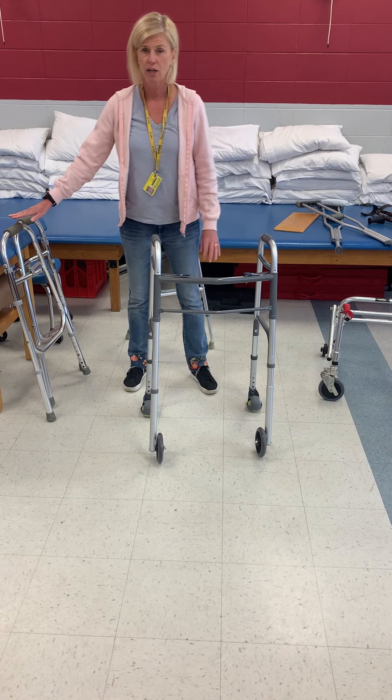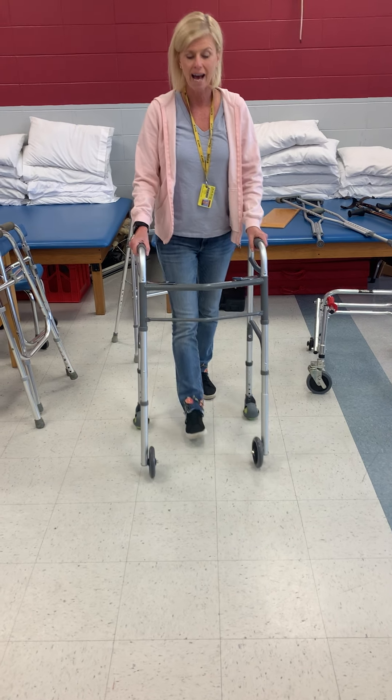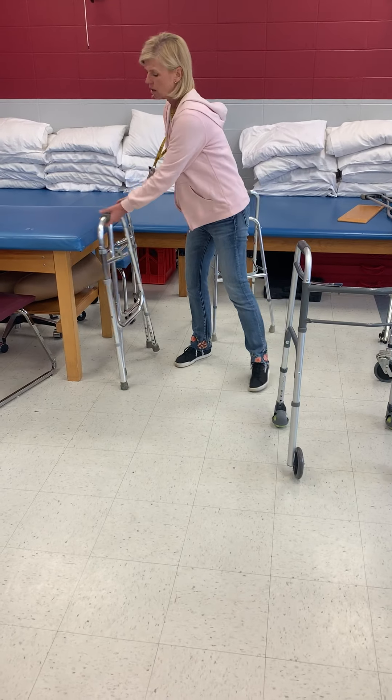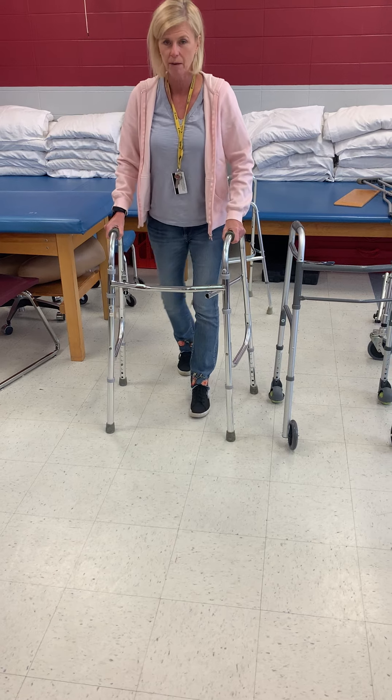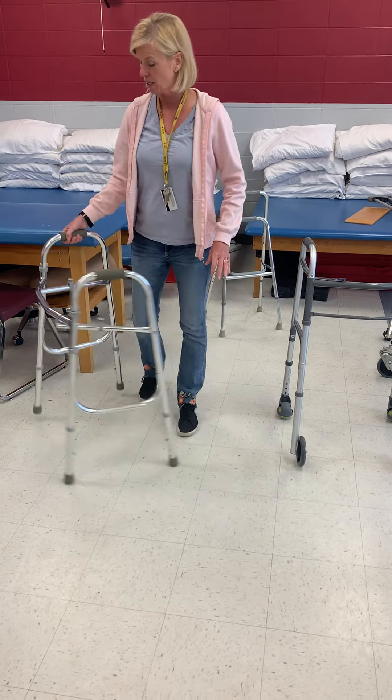This is usually a progression from a standard walker, and the reason for the progression is so that they can have a more normalized gait pattern. With a standard walker, when they're walking they have to advance the walker, step, step — advance the walker, step, step — and so it really slows the patient down.